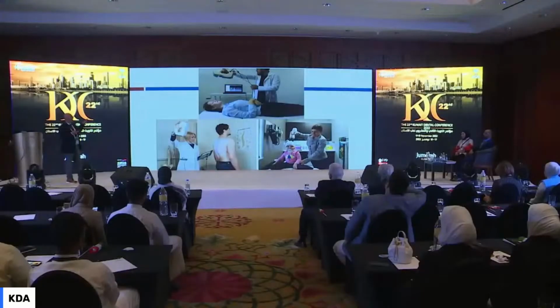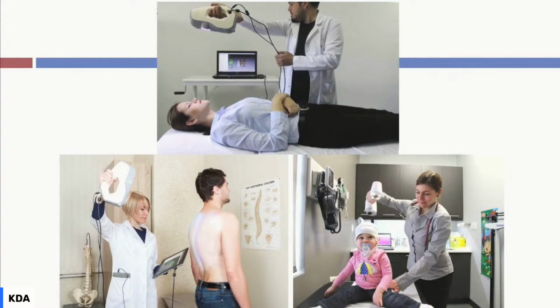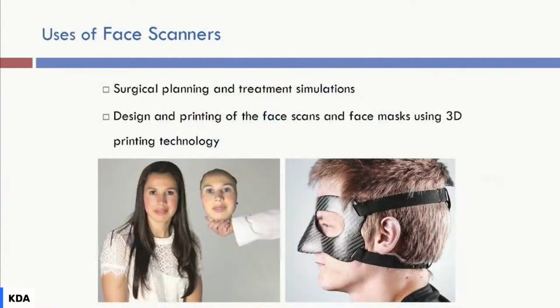In the medical field, it's mostly being used in plastic surgery, in maxillofacial surgery and orthopedic surgery. So for the treatment of scoliosis and assessment of deformities of the vertebral column, 3D facial imaging is being used. But in the last few years, you also have 3D printing. So we were able to augment the use of 3D facial scanning in addition to 3D printing to come up with something more innovative.